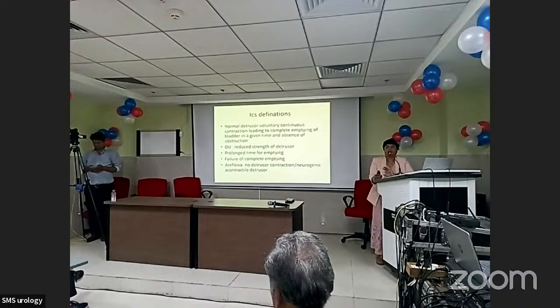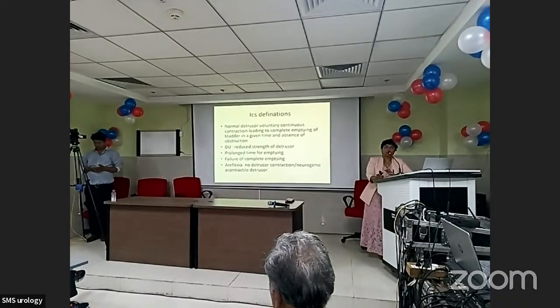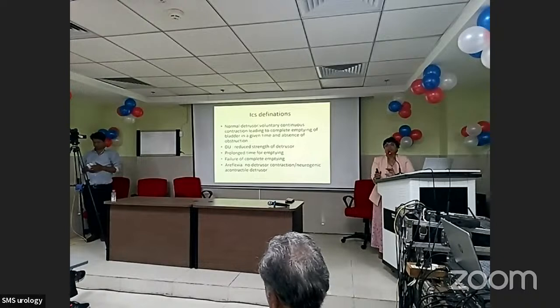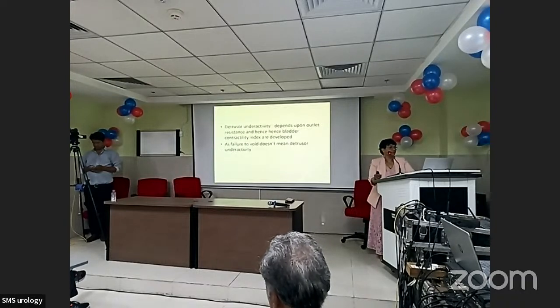So you understood? One is normal voiding, one is the gray zone, which we don't know, and we will learn more as we go ahead, is DU. And the third part is very easy. Detrusor is not acting, it is not contracting, and that is where we call it neurogenic or acontractile detrusor.